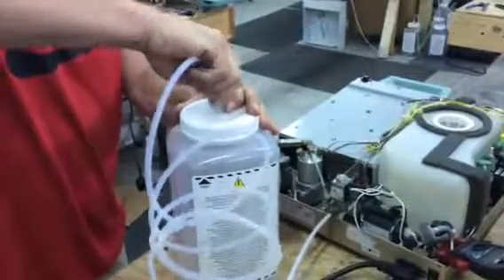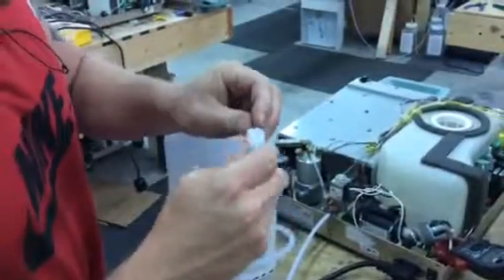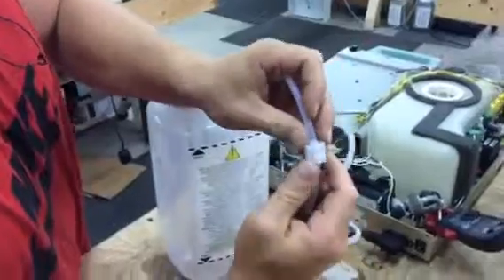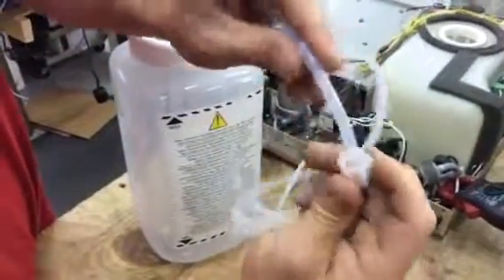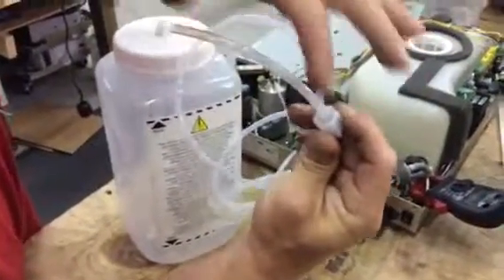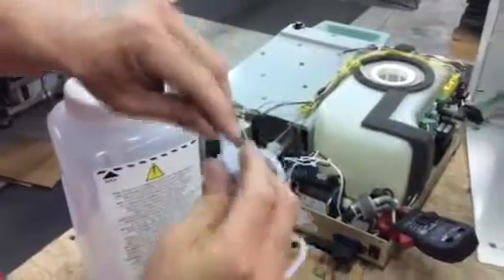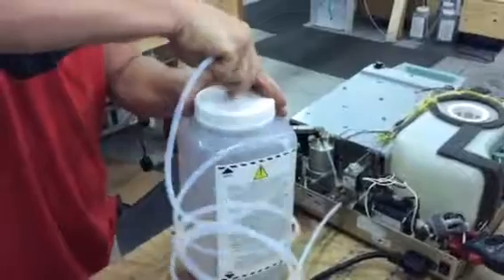Just real quick — if the spacer, or the retainer ring I guess it would be called, and the ferrule come off: the nut goes on first, then the retainer ring, then the ferrule, and then you screw it down and push it down like so. As you tighten it, it will lock into place and not leak.